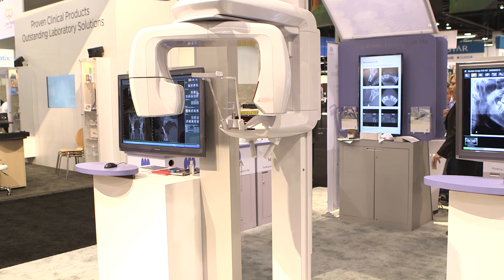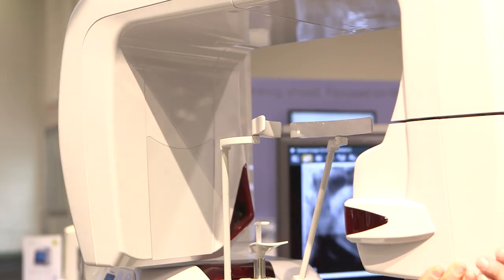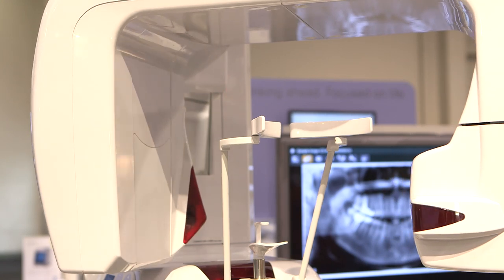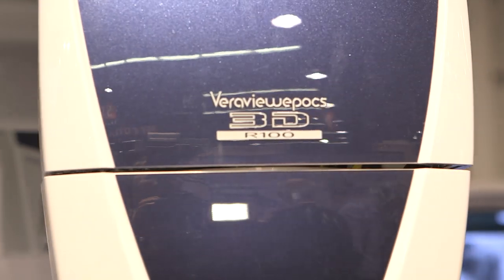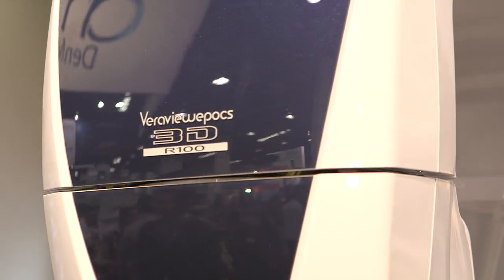We have a machine that we launched approximately a year and two months ago called the Veriview Epochs R100. The R100 is our hybrid stand-up cone beam machine, like this one here, that takes a traditional 2D pan and also does cone beam in six different fields of view.